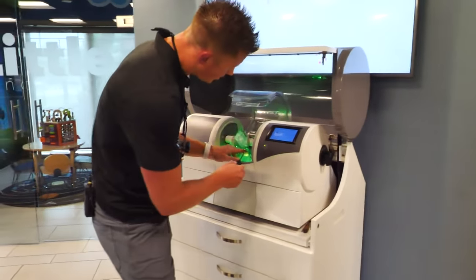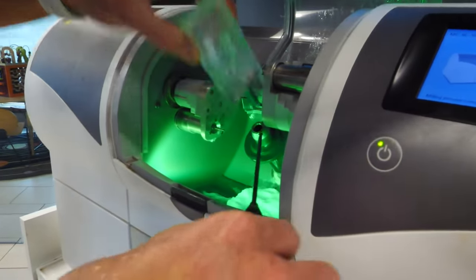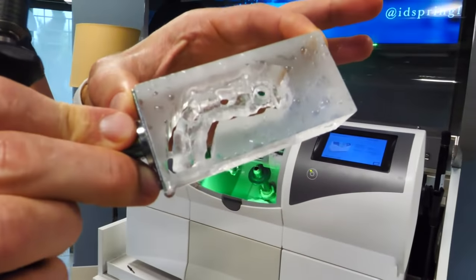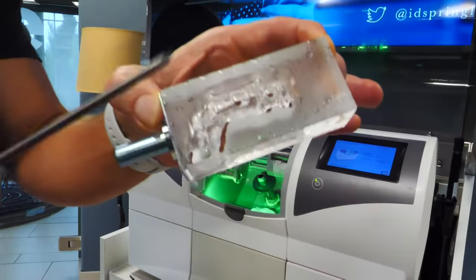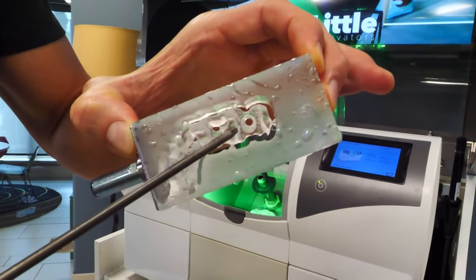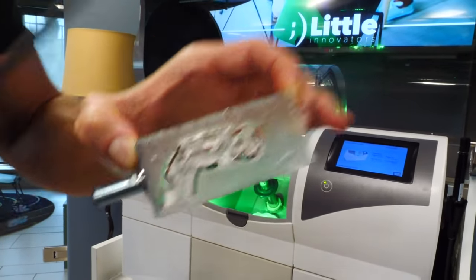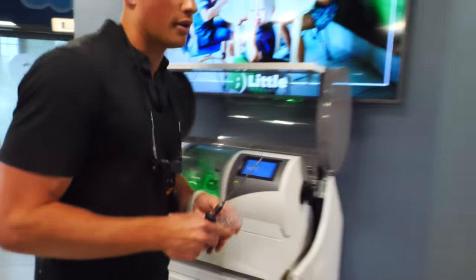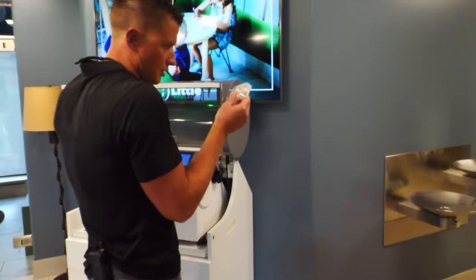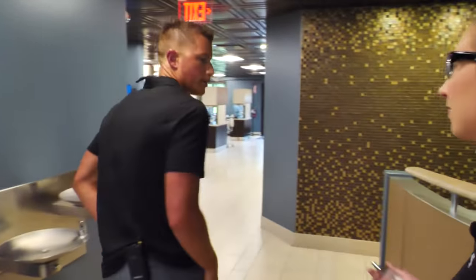So now it's time to get this block out, and you'll be able to see here pretty clearly. You see, there's the guide. You can see the access there for the implant. So that's where the implant will go, right there in that little hole. Pretty cool. We're going to get this cut out, and then we'll place our implant. Now, I'll let you, Des, go get that off of the block, and then I'll go give some anesthetic to Trey. Sounds great.